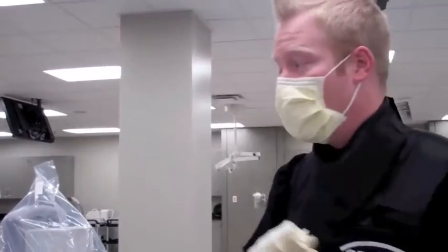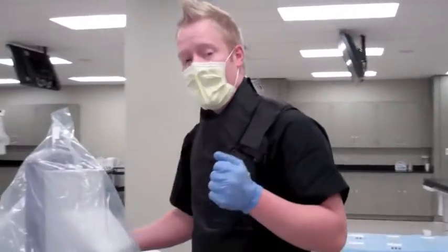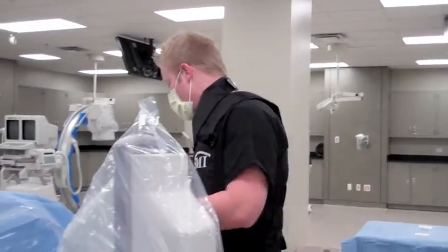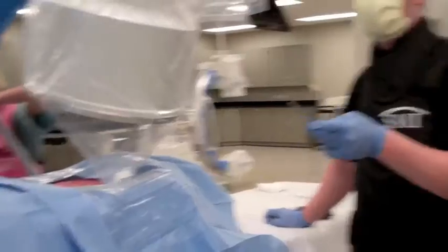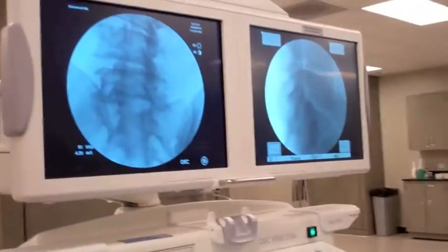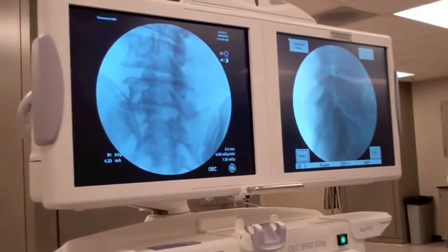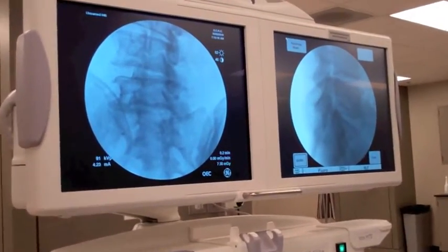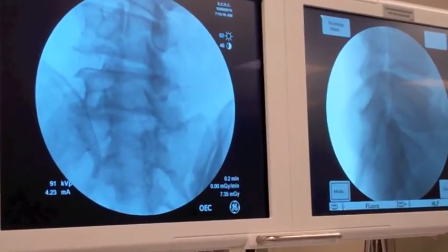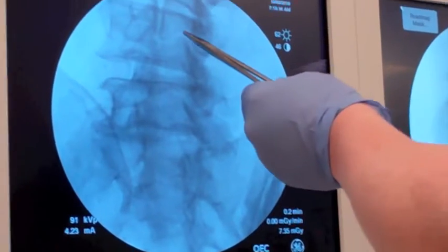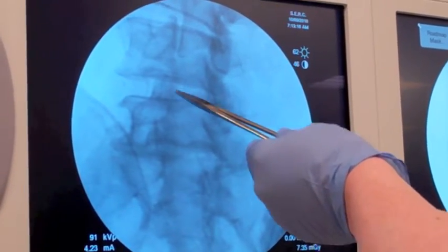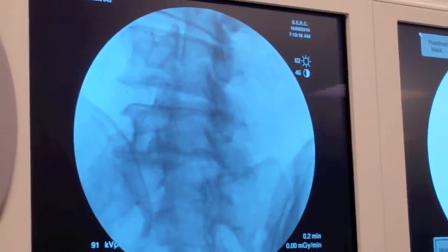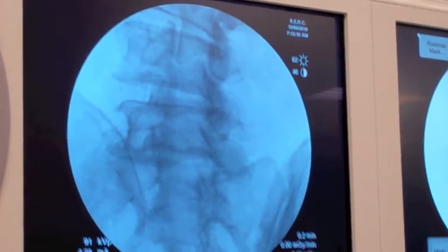I'm going to go ahead and walk you through the procedure. We do this with x-ray guidance. This is an AP projection of the lumbar spine, and what you see here is the L4 vertebral body and the L5 vertebral body. I'm going to do this procedure at the L4-5 level.